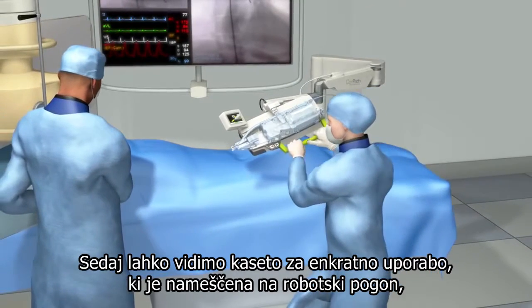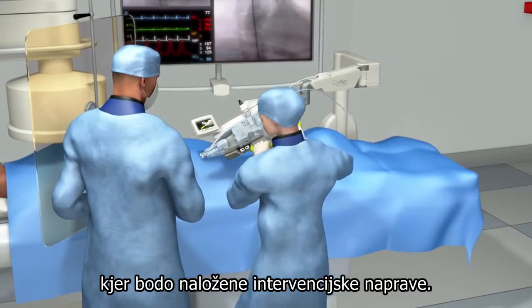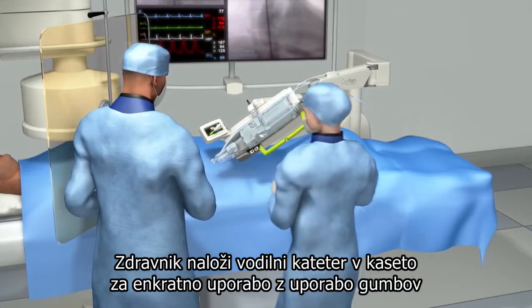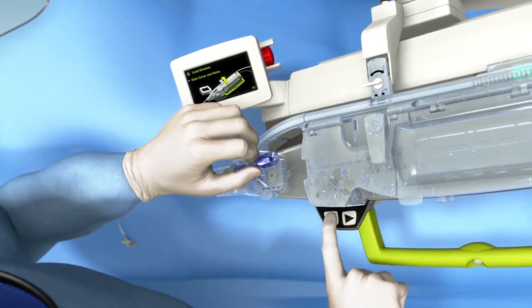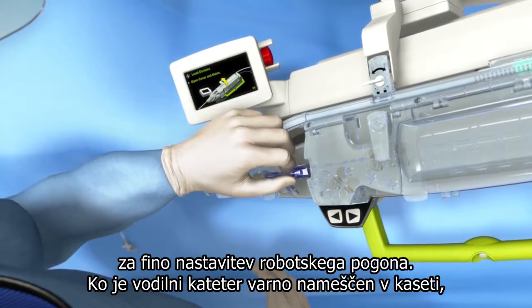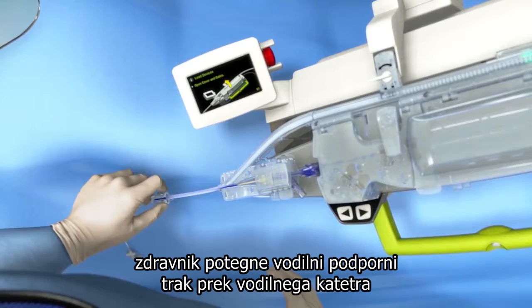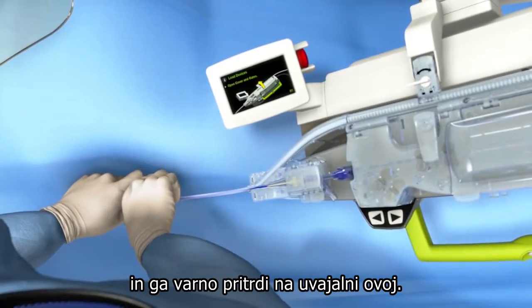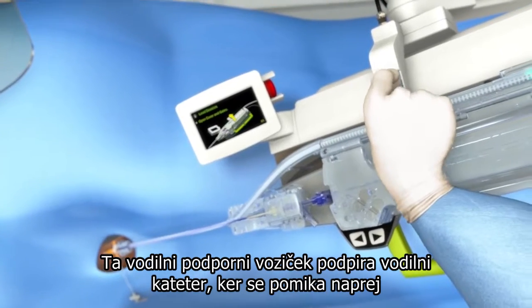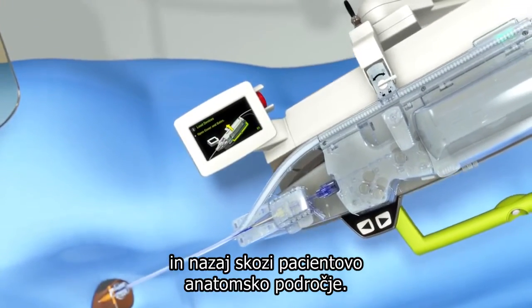You can now see the single-use cassette mounted on the robotic drive, which is where the interventional devices will be loaded. The physician loads the guide catheter into the single-use cassette using the fine-tuned controls on the robotic drive. With the guide catheter securely in place within the cassette, the physician pulls the guide support track over the guide catheter, securely attaching it to the introducer sheath. This guide support track supports the guide catheter as it is being advanced and retracted within the patient's anatomy.